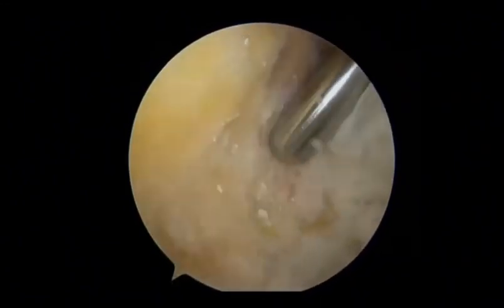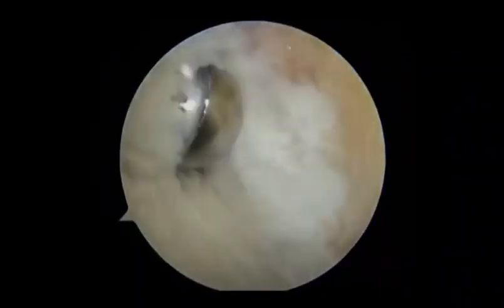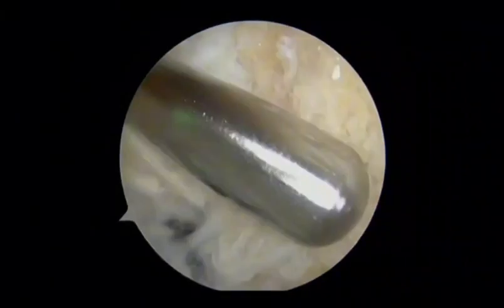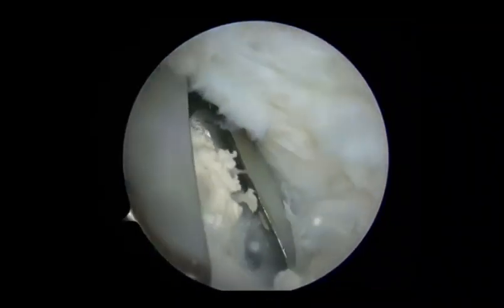Next, the urate crystals deposited on the posterior side of the patellar tendon and on the proximal patellar tendon insertion are cleaned, taking care to preserve the patellar tendon tissue and avoid damaging the insertion point. Finally, a sample of the urate crystals is taken for pathologic examination.